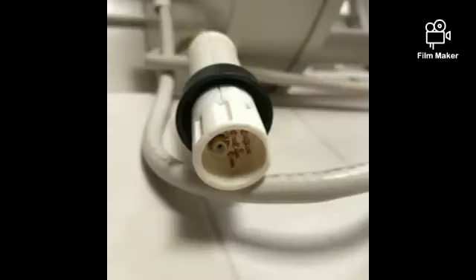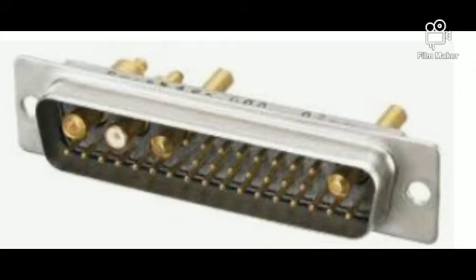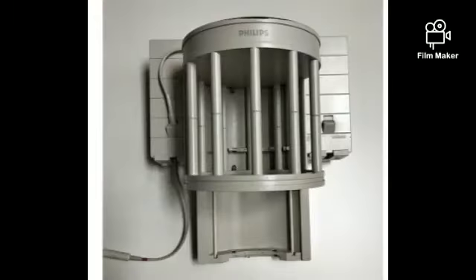So now we will return to our topic. These are the connectors of various MRI coils. This is the 5 channel connector, this is the 16 channel connector, this is the 32 channel connector, and this is the 8 channel connector. When you are connecting any of the MRI coils, keep in mind that you connect them to the exact port, otherwise the pin will break, and if the pin breaks, it will damage the full coil. It will not give any signal, and that will be a loss for you and your company too.